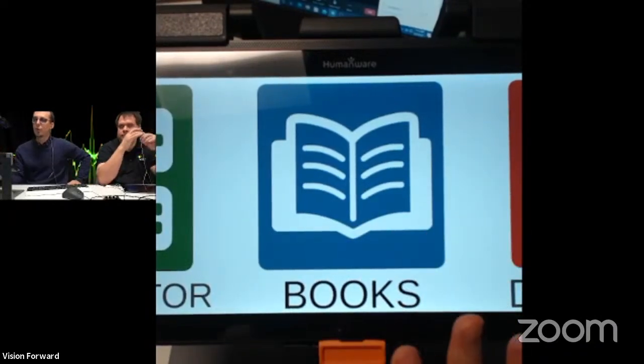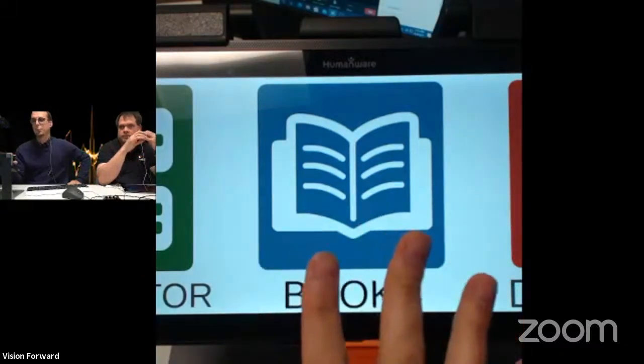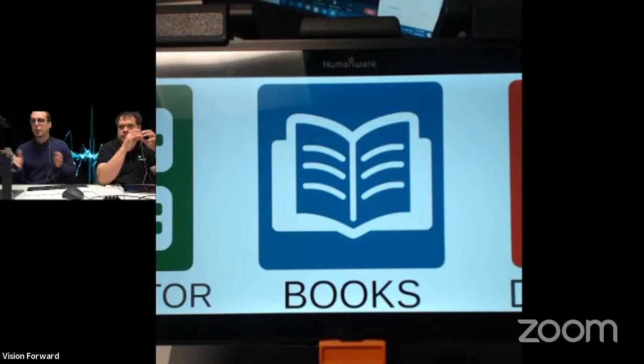And when we turn on this device, we are looking at a specific app which essentially takes over the system in a sense. When you turn the system on, you're not seeing Android, and this is an Android-based tablet, but you're not seeing that. You're seeing this specific software, which is the Prodigy software.